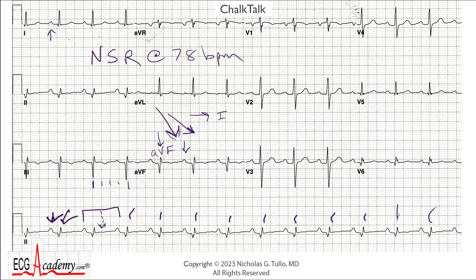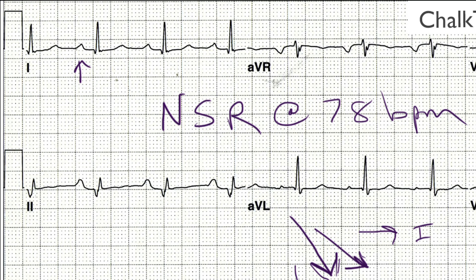Now let's look at some intervals, zooming in a little bit. This first P wave starts on a heavy line, and the QRS complex starts just past the next heavy line. The heavy lines are 200 milliseconds apart, so the PR interval is about 210 milliseconds. That allows us to make a diagnosis of first-degree AV block — granted, it's borderline, and some people would not notice it, but for the sake of being complete, we can make that diagnosis.